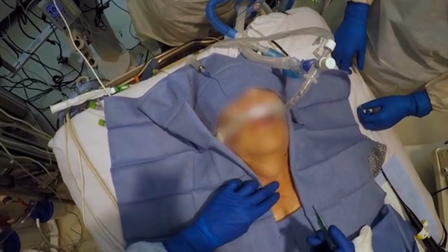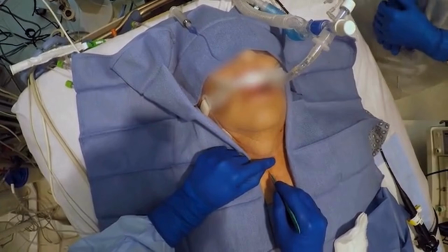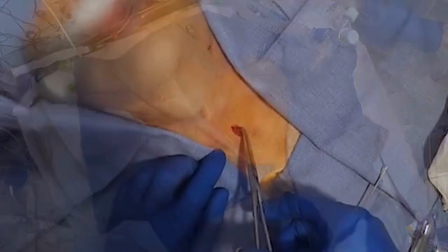Sterilize and drape the anterior neck, ensuring easy access to the oral endotracheal tube. Next, make a 2 to 3 centimeter vertical neck incision directly over the trachea below the cricoid cartilage. Bluntly dissect pretracheal tissue until the trachea is palpable.